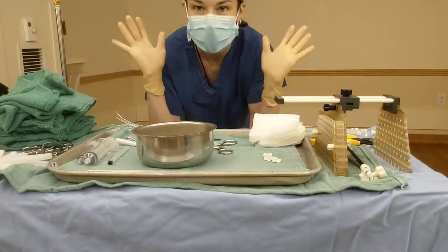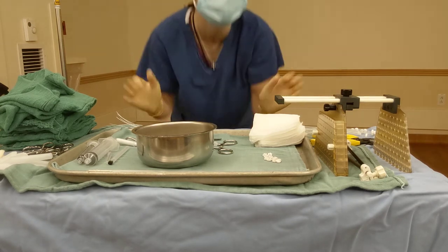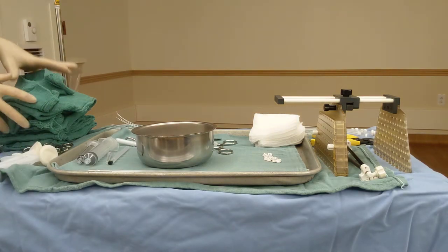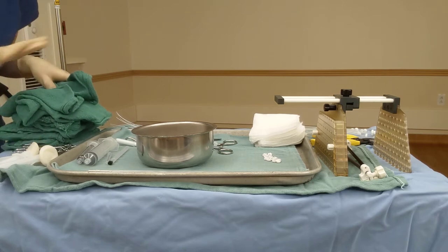Today we're going to talk about how to set up a sterile tray for multi-catheter breast brachytherapy. We've got everything we need here: chlorhexidine to prep the skin, sterile towels, and some clips to make a sterile area.